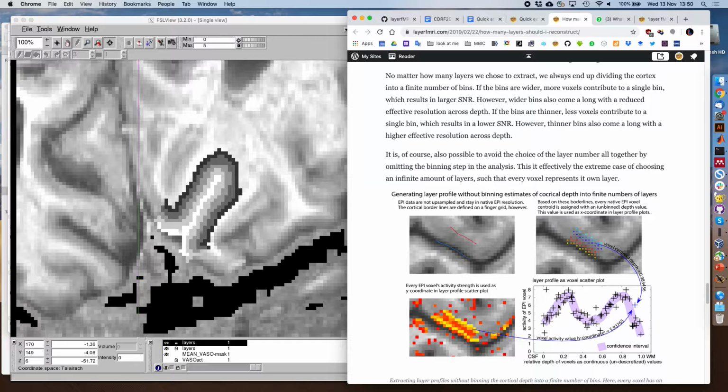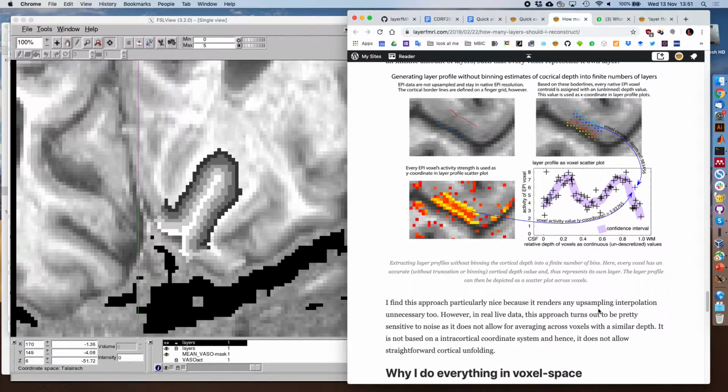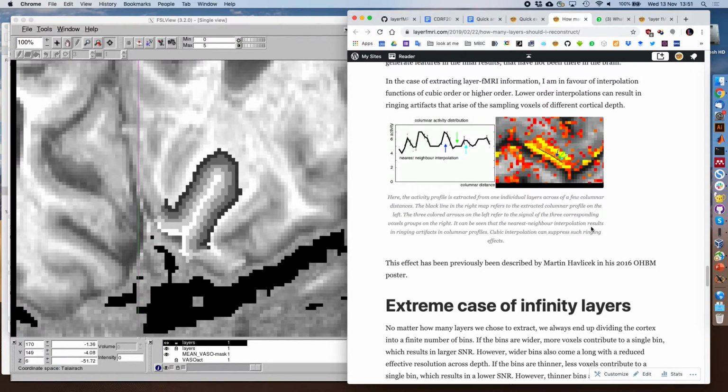Similarly, when you do a time course analysis in GLM, sometimes you censor data points where you have motion, and then you just have a missing data point, and you need to acknowledge that in your statistical analysis. But it doesn't mean that you need to interpolate it or anything. Just use the data points that you have without any bin size at all. But if you need to choose bin sizes, choose the bins as small as possible.